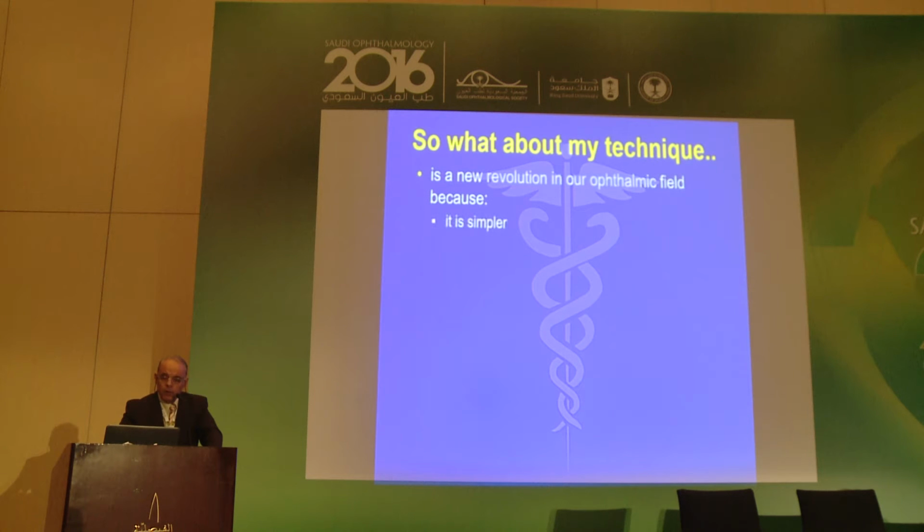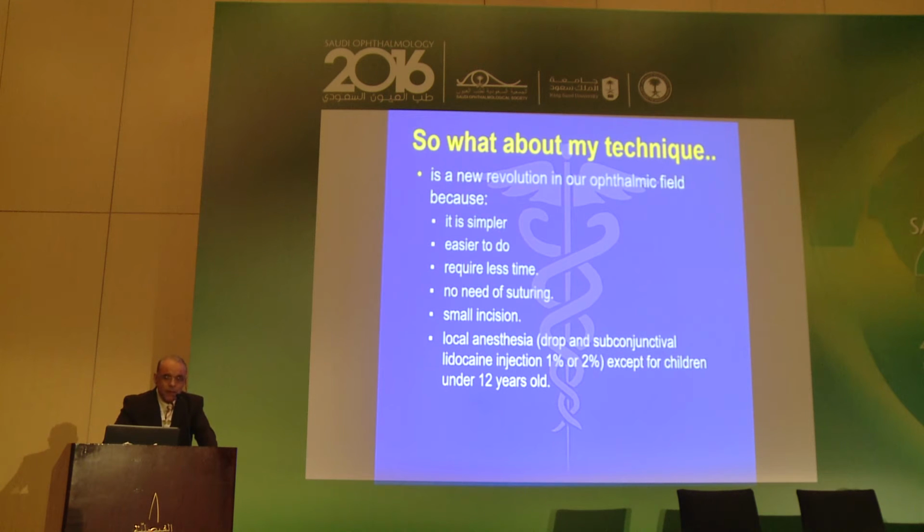So what about my technique? I think it's a new way and a new revolution of ophthalmic technique, because it's simpler, easier, requires less time, not more than 15 minutes. You can do only myectomy, evaluate the case, and you finish. Small incision also, not more than 8 or 10 millimeter maximum. Local subconjunctival anesthesia around the muscle only is enough, no pain.